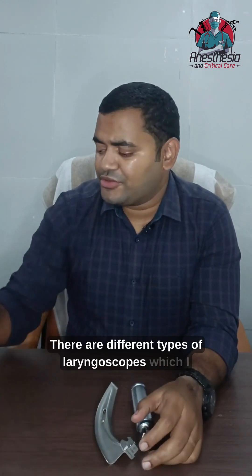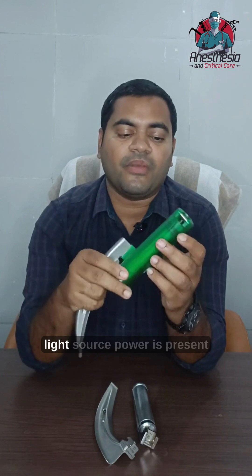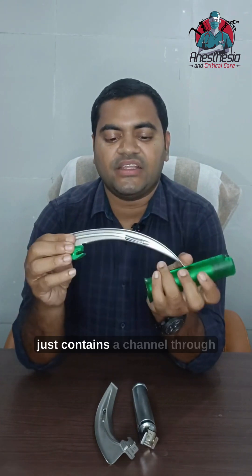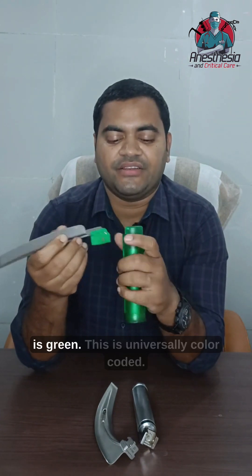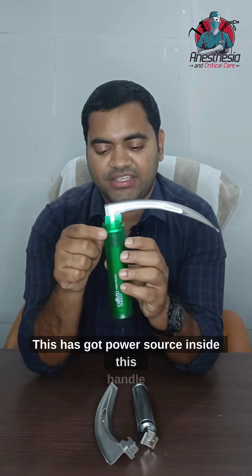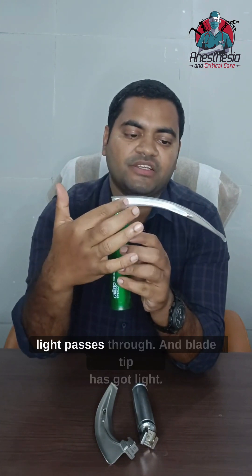There are different types of laryngoscopes which I will be showing. This is a fiber optic illuminated laryngoscope where the light source power is present in the handle. The blade contains a transparent channel through which light passes through. This is color coded in green, which is the universal color coding for this type.